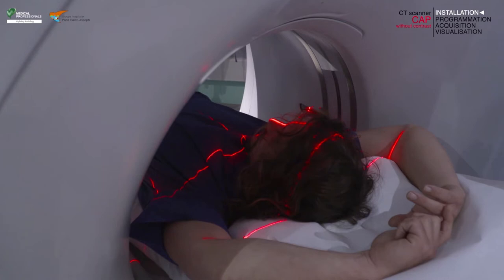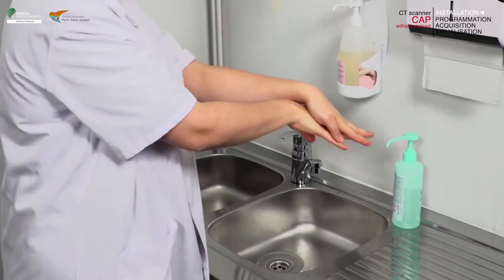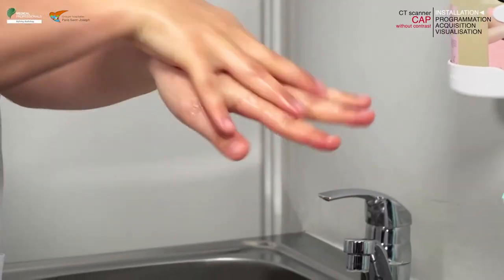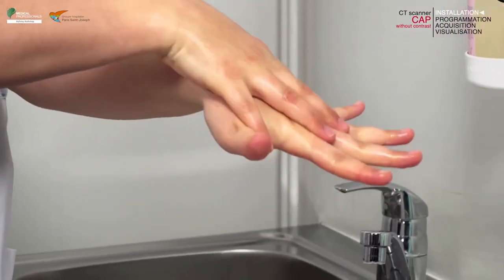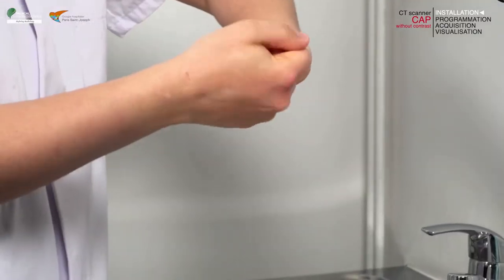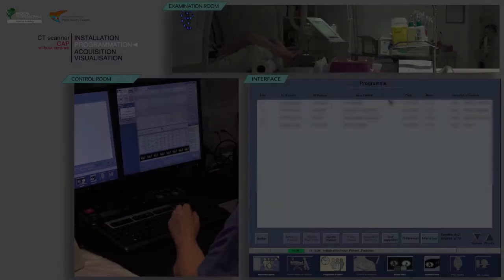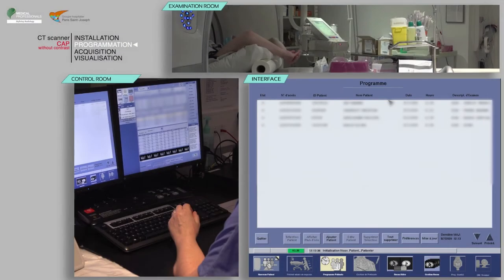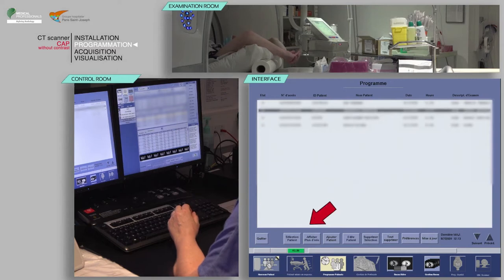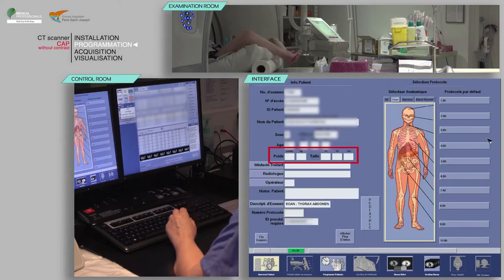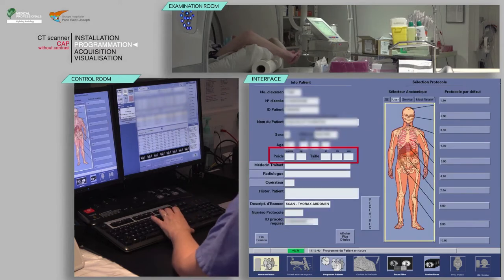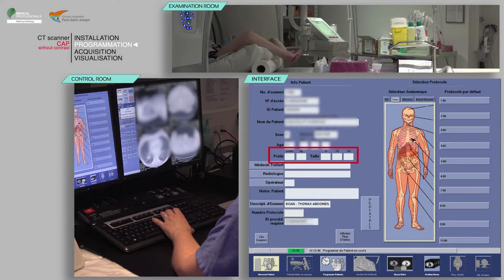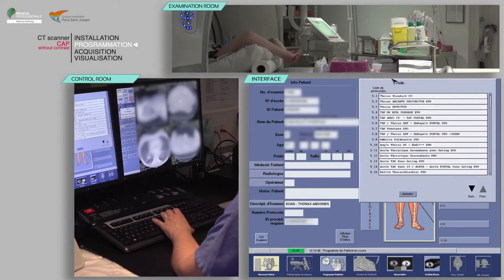Remember to close the doors of the examination room and perform proper hand hygiene, such as use of a rub with alcohol-based hand sanitizer. Select your patient from the worklist, then click on Patient Selection. Verify the pre-filled information and fill in the patient's weight and height.